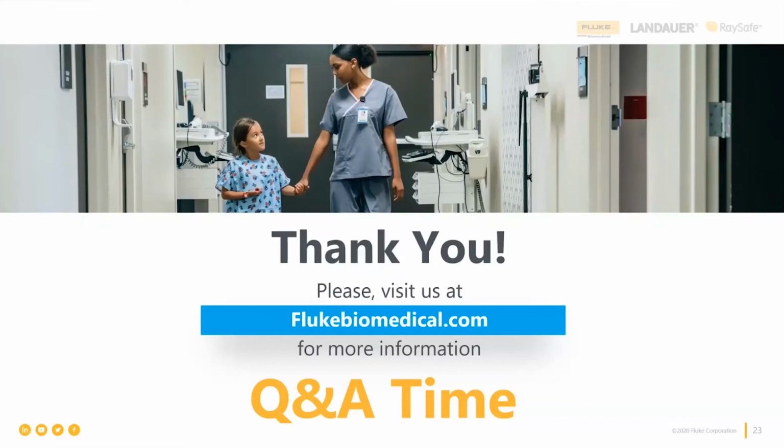not every time I test in any case, but certainly on incoming inspection, whether that defibrillator is brand new or if I had to send it out for repair and it came back, that's another instance of incoming inspection. I want to run it through its whole paces. I want to see at least the maximum output energy across more than one of those test loads that we talked about. Okay. And after repair, if I've done the repair in-house.